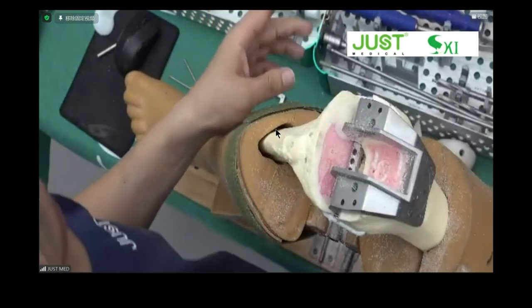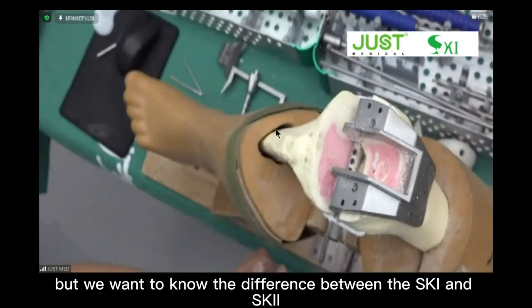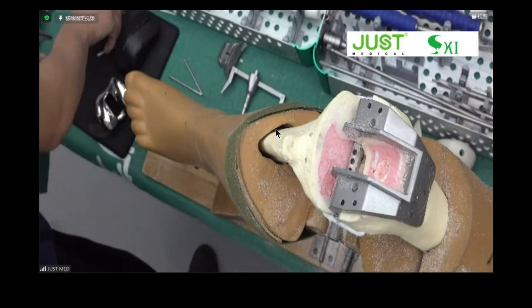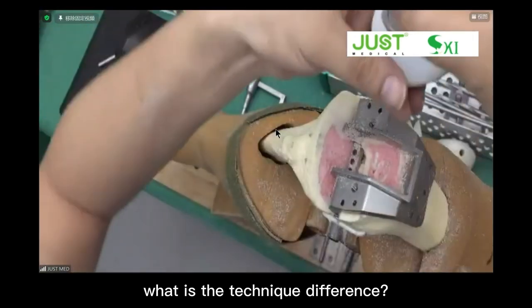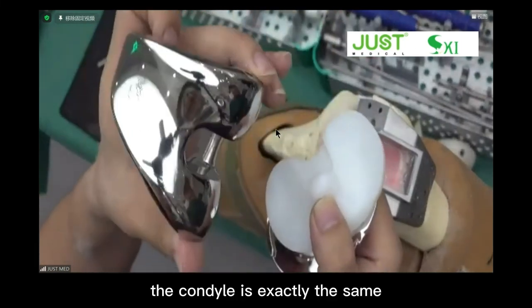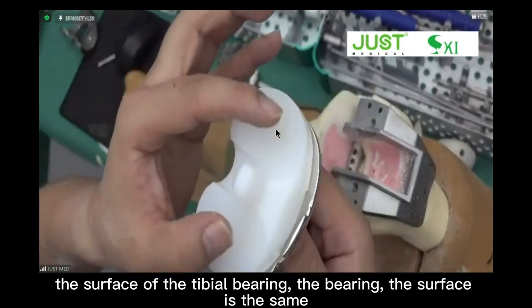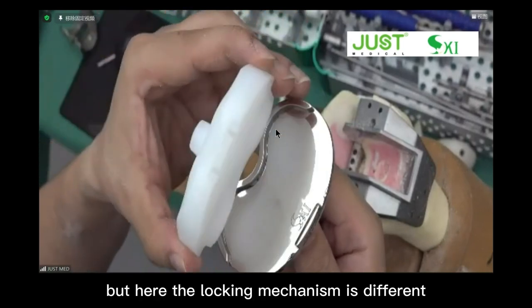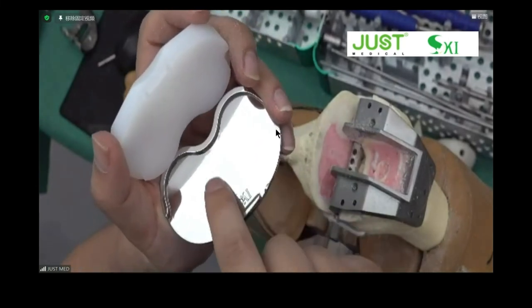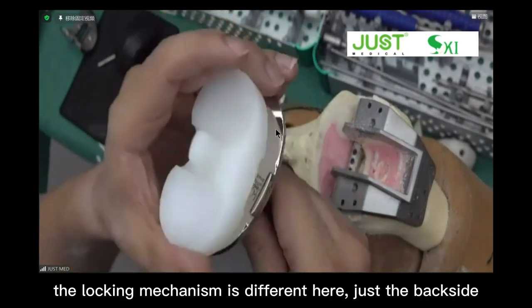I have another question. It is not related to the procedure, but we want to know the difference between the SK1 and SK2. SK2, I can show you. So what is the technique difference? Yeah, this is SK1. SK2, actually, the condyle is exactly the same, and the surface of the tibia bearing is the same. But here, the locking mechanism is different. The SK2 is like the tail of a swallow, like the tail of a bird. The locking mechanism is different here, just the backside.